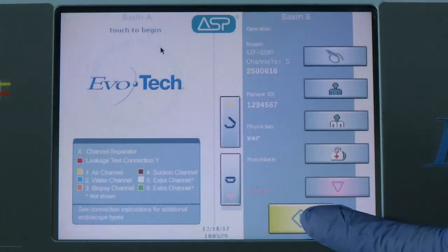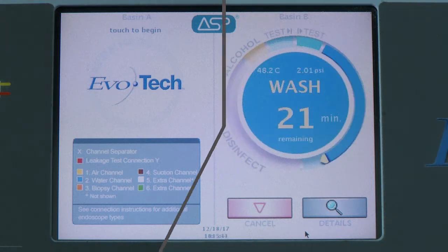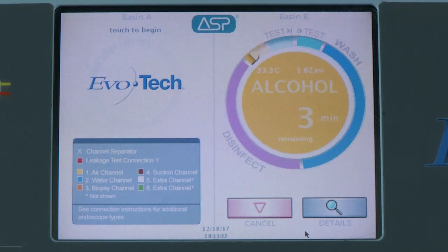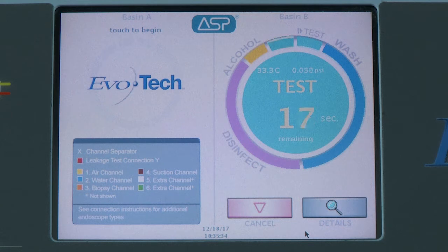A leak test is performed in the EVOTECH at the beginning of the cycle to check for large leaks that would prevent the endoscope from being reprocessed, and is necessary prior to the endoscope coming into contact with water. The endoscope is pressurized throughout the cycle to prevent invasion of liquid. Just prior to the end of the cycle, the endoscope is again checked for leaks.